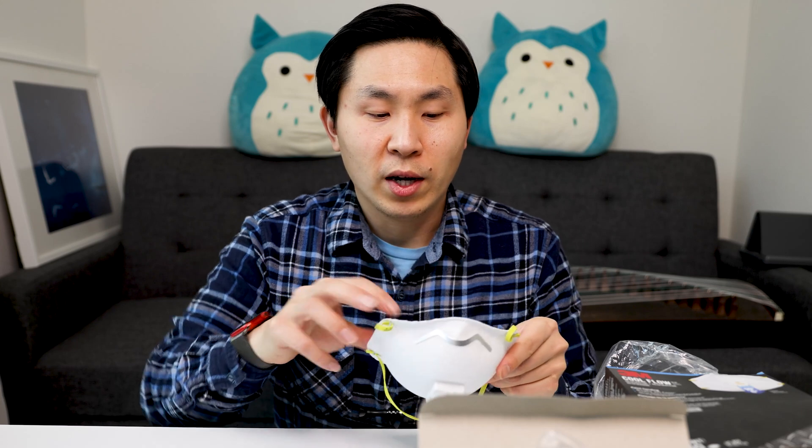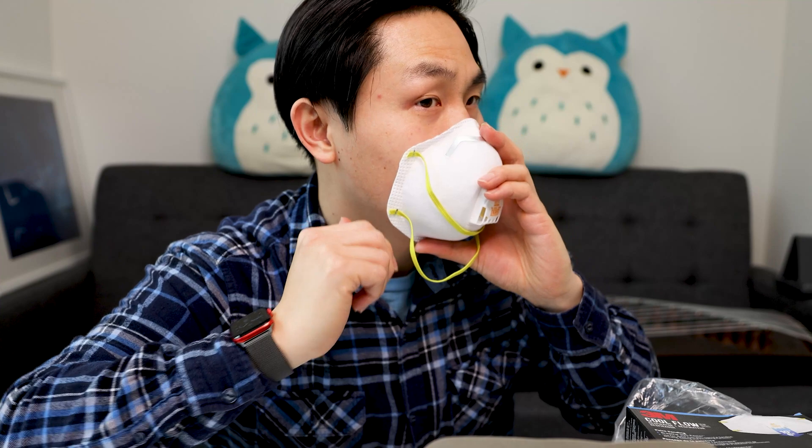First, it makes it more apparent for people to know that you are not wearing a mask with a valve. Secondly, it actually provides a better seal. Because as you can see here, there is a lot of surface that needs to be touched in order to make the seal. So you don't want to wear another layer underneath it because it might create a gap on the side.